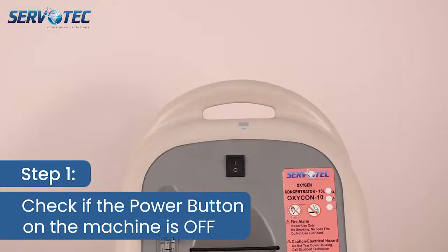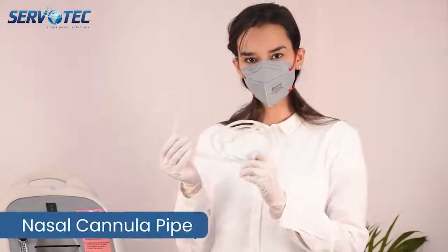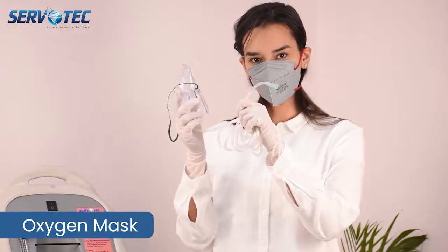Step 1. Please ensure the power button of the machine is off. This is nasal cannula pipe, oxygen mask, nebulizer.